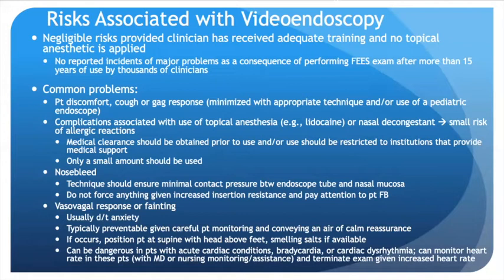There's a risk of nosebleed. So your technique should ensure that there's minimal contact pressure between the endoscope tube and the nasal mucosa. And if there's any kind of resistance that you encounter, do not force anything. Also pay attention to patient feedback.